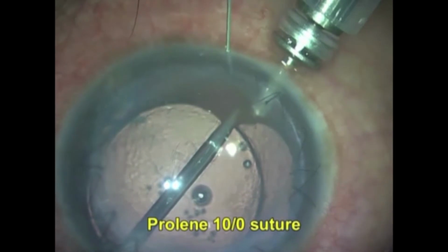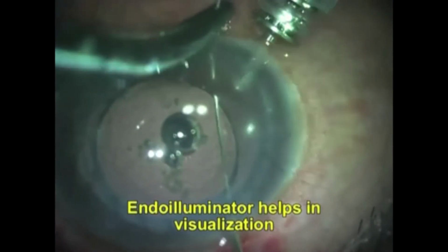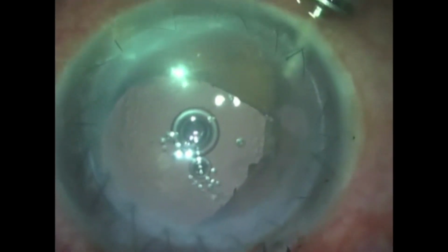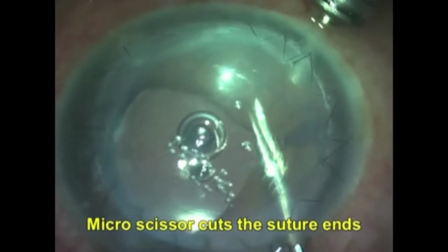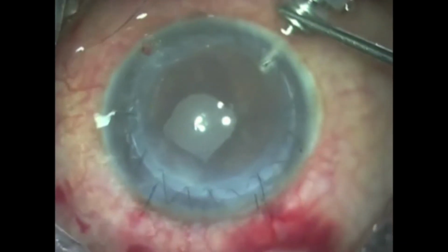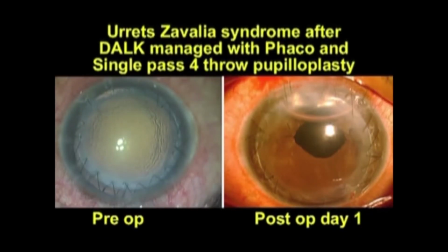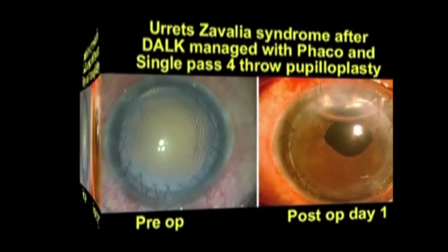In a case of Urrets-Zavalia syndrome, prior to doing single-pass 4-throw pupilloplasty, pupillary stretching is performed at every clock hour, wherein the pupillary edge is pulled with an end-opening forceps with an aim to release the pre-existing peripheral anterior synechiae from all quadrants of the angle. Once the iris has been released and is comparatively mobile, pupilloplasty can be performed.